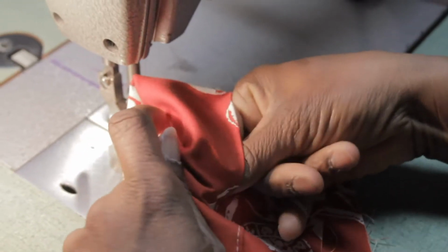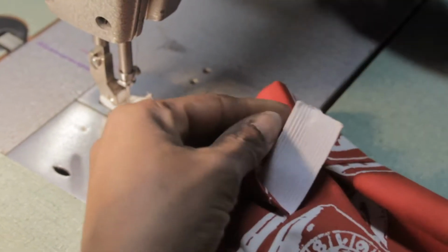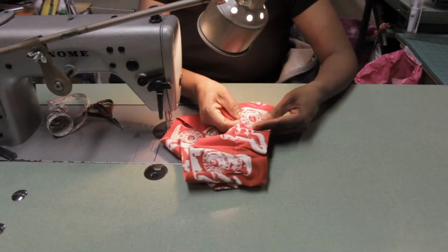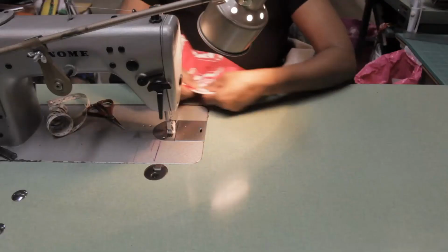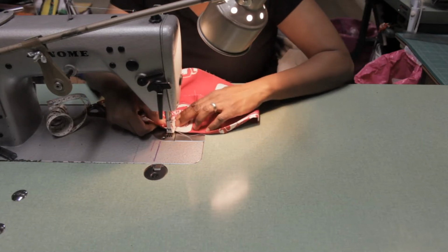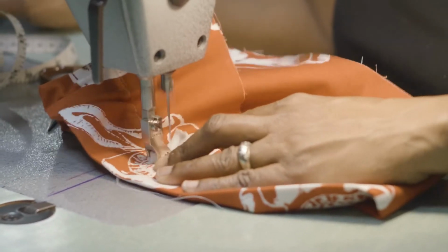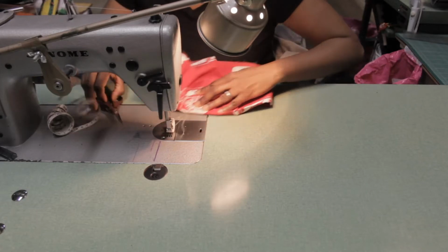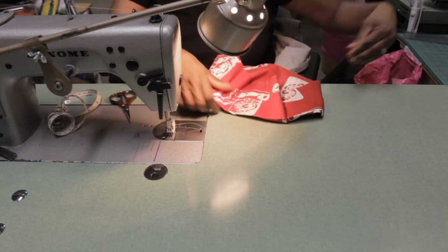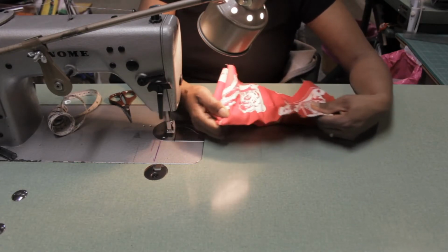Now we're going to pull the elastic through to the other side. We can take the pin off, and again we're going to make sure that the elastic gets caught on this side of the stitch line, and we're going to do the same thing. We're going to just run a straight stitch back and forth a few times. This is just to secure the elastic to make sure that it does not pull out, and we're going to clip our seams. So now we have kind of an adjustable bit for our cap.